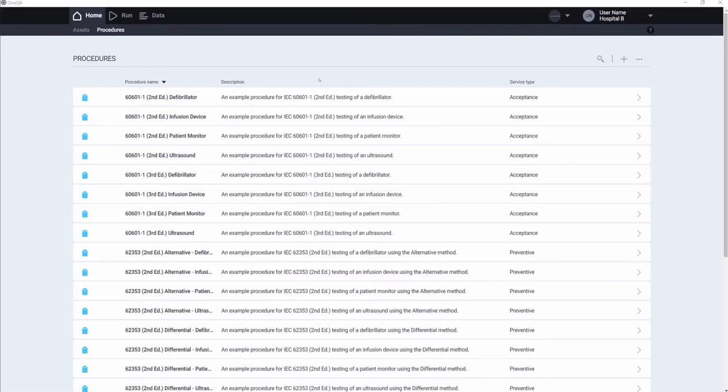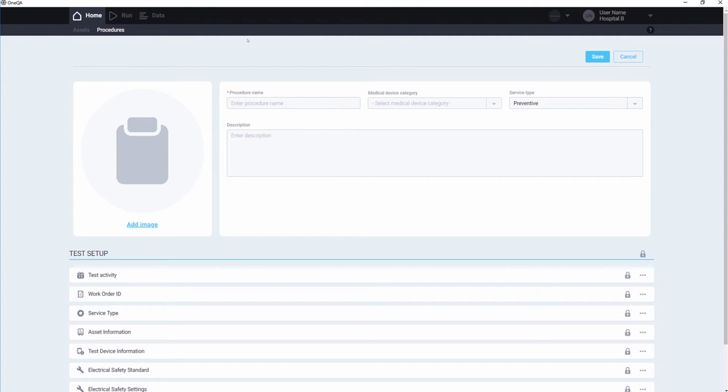In this video, we'll cover creating a custom procedure, which can be done by either starting from scratch or editing one that already exists. So, to start from scratch, we'll add a procedure and give it a name. We'll assign it a medical device category that we're designing for.